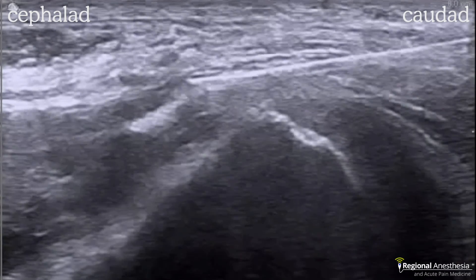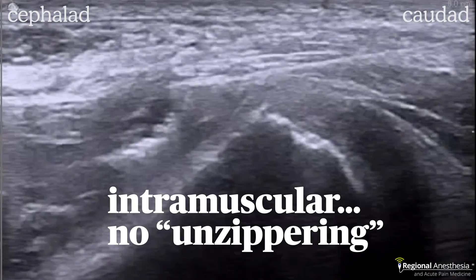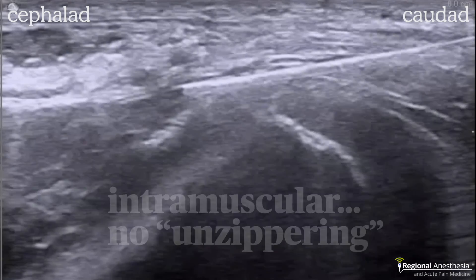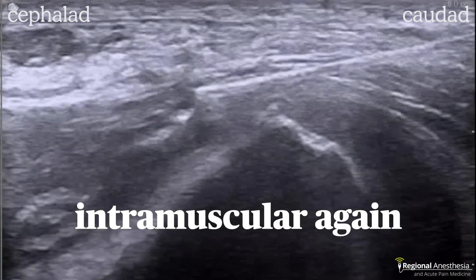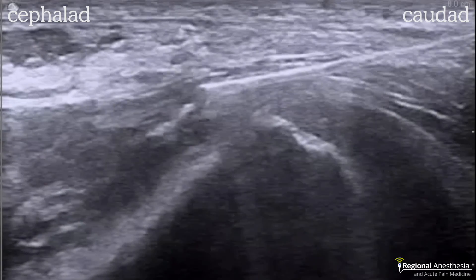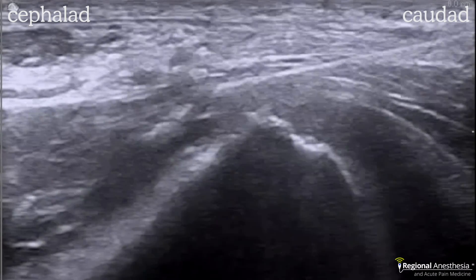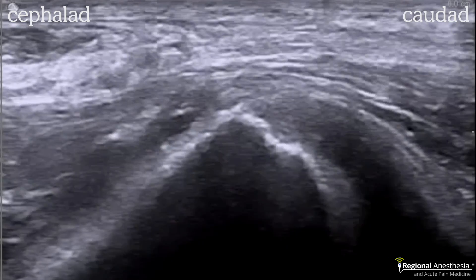A test injection here shows intramuscular spread — the tip was not in the correct fascial plane. Again, intramuscular injection. It's good to see what an intramuscular injection looks like because those represent failed blocks; there's little chance the local anesthetic would spread to the relevant structures when trapped inside the muscle.